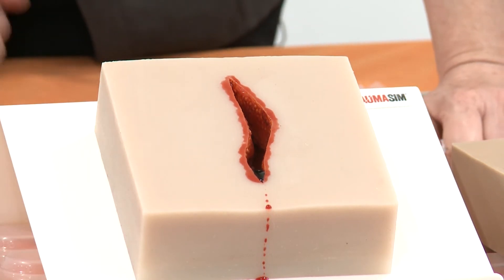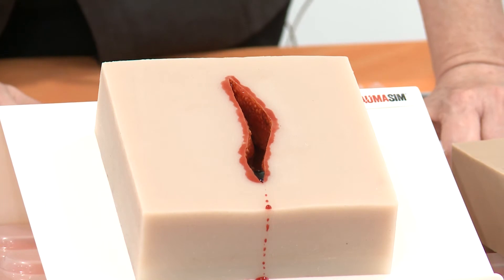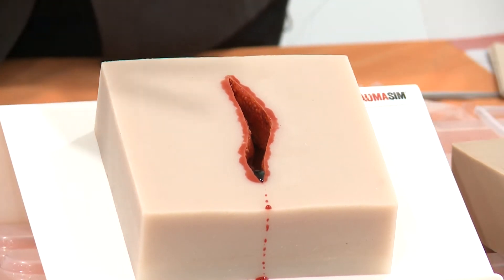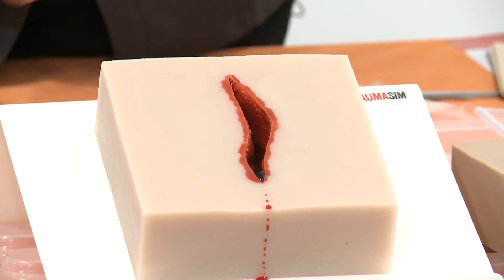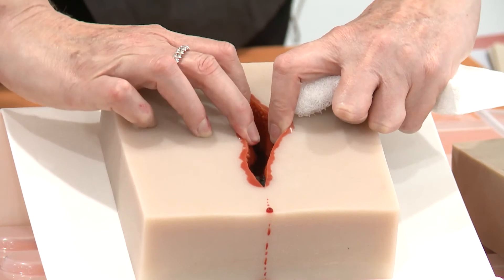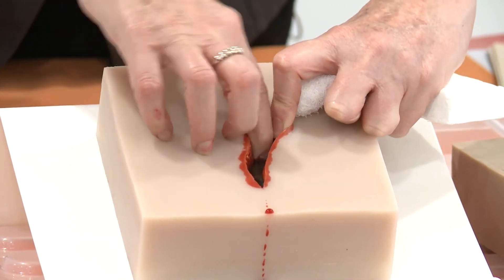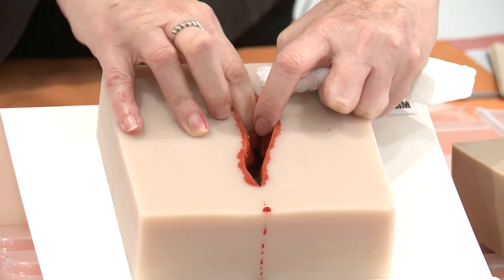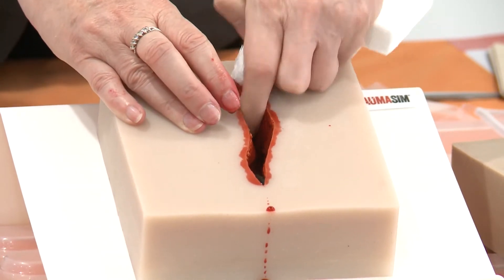You teach them the lesson. To be clear, today I'm not teaching you how to teach haemorrhage control, but we're covering all about the training aids. Once it's flowing, you can do your lesson of how you would treat that, what you would do, how you would find that source of the bleeding. Basically, they can look in there, feel in there, and see where that point is.